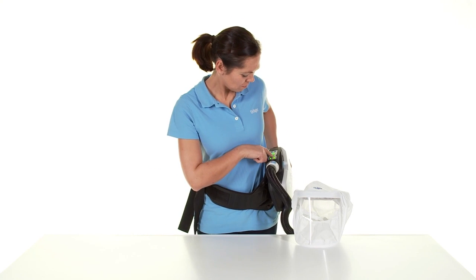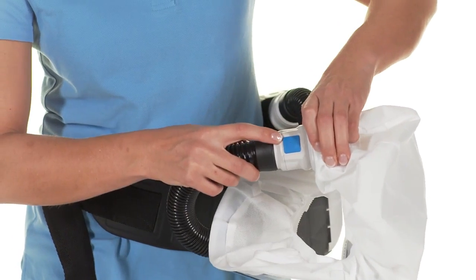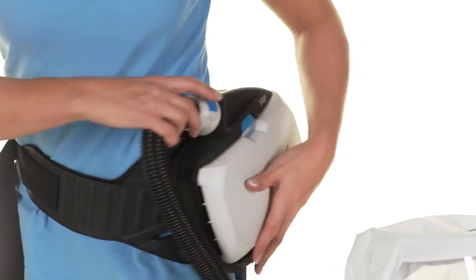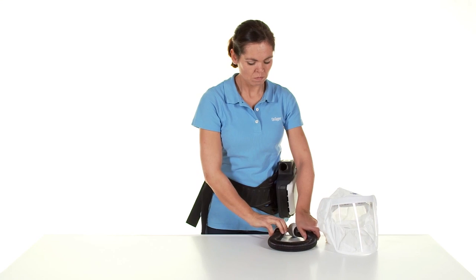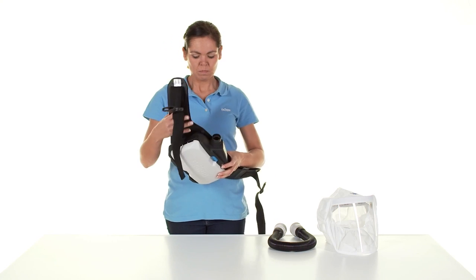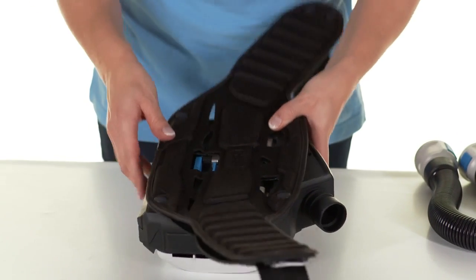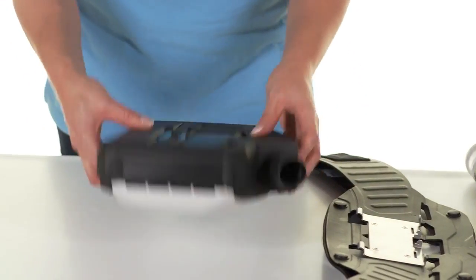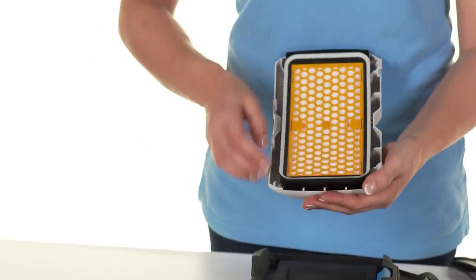Turn off the unit by pressing the green button for 2 seconds. Disassemble the device in reverse order — to do this, press the respective blue release buttons. Then the components must be cleaned as indicated in the instructions for use.